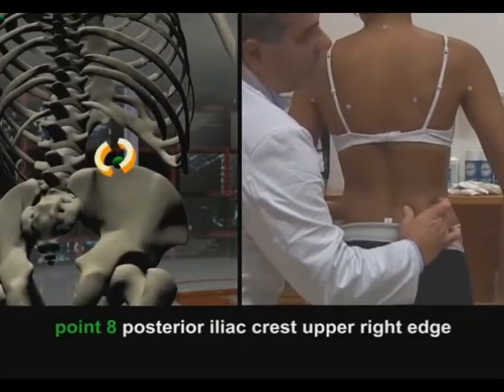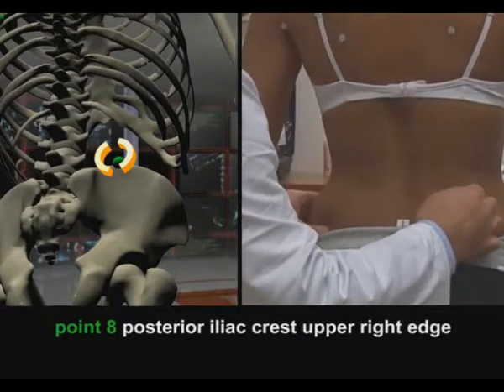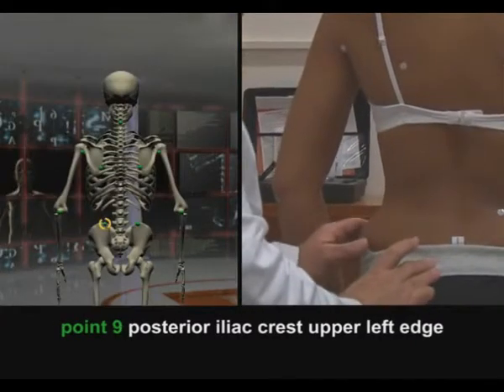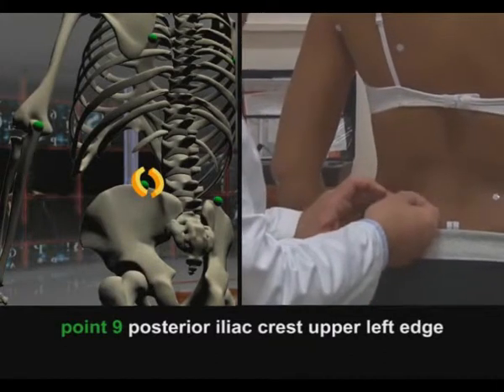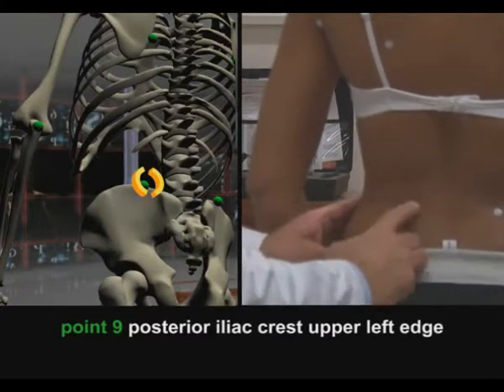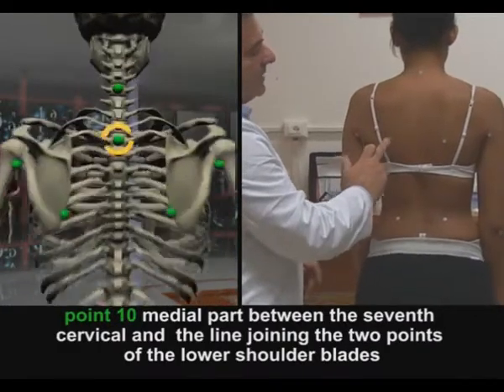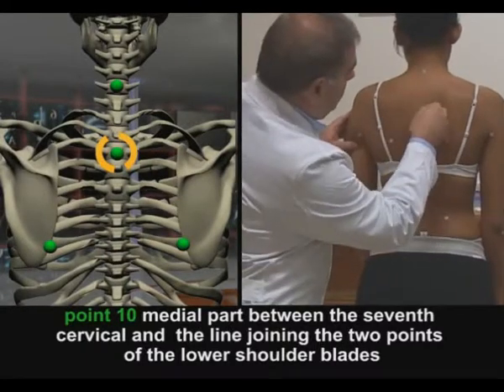posterior iliac crest, upper right edge, posterior iliac crest, upper left edge, medial part between the 7th cervical and the line joining the 2 points of the lower shoulder blades.